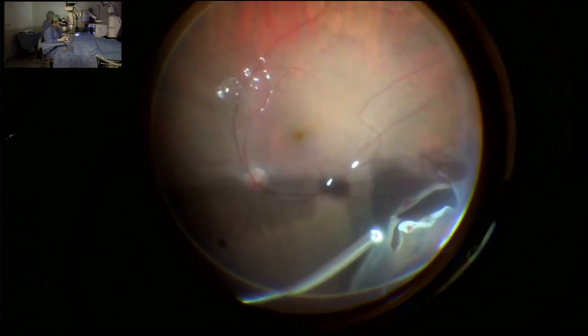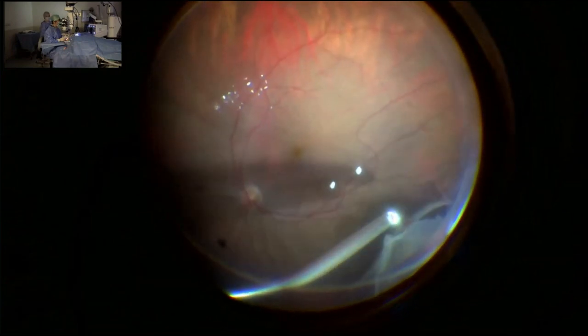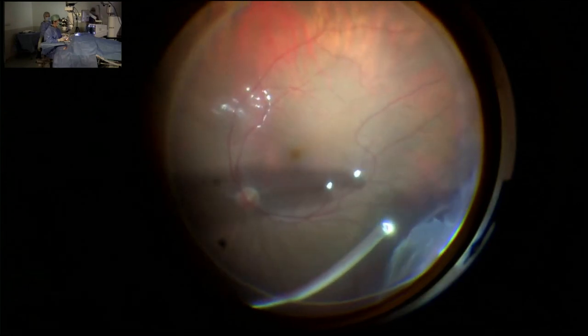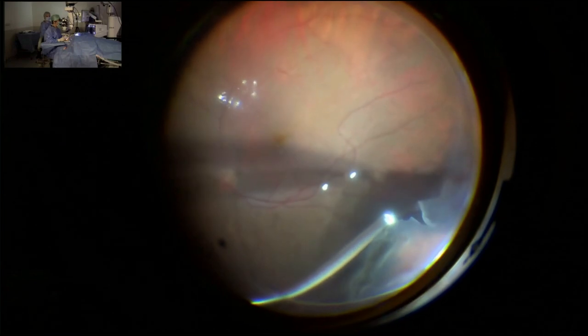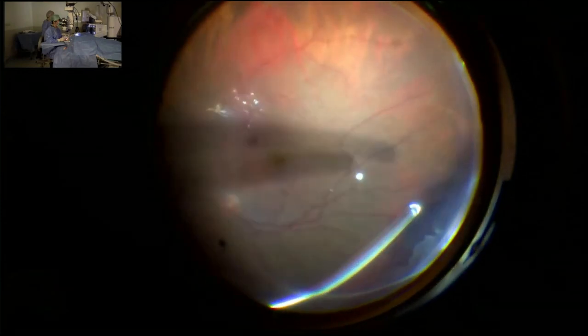So now we are on the retinal tear area. So we cut the retinal flap, as you see here, but there is a bridging vessel here, and therefore I will do diathermy before cutting that, to prevent bleeding. But let me finish the vitreous first. So as you see, this is a shaving mode, and the vitreous and retina are very stable, and there is not big danger to make an iatrogenic retinal tear. Use this in the standard vitreous base shaving, but if there is a fresh retinal detachment, if the retina is very mobile, I prefer this shaving mode. Maybe it's time consuming, but it's much safer compared to the standard system.